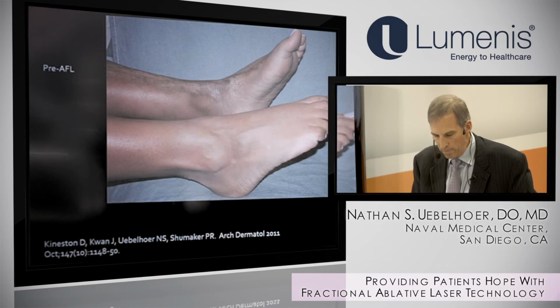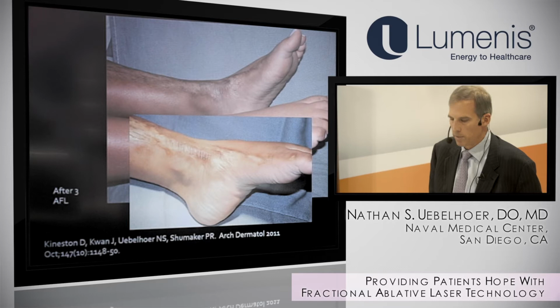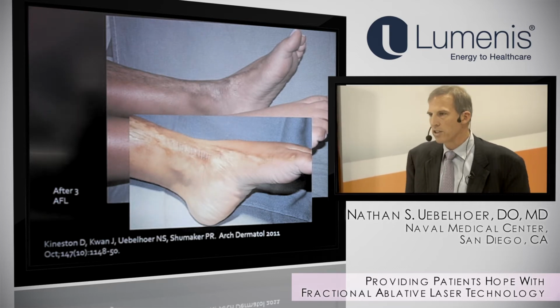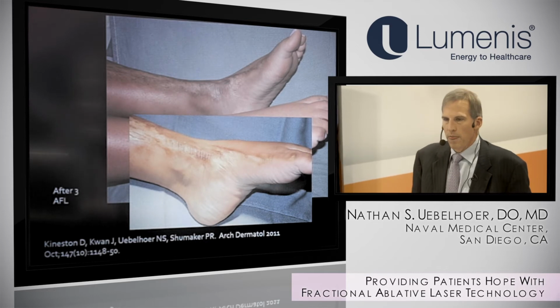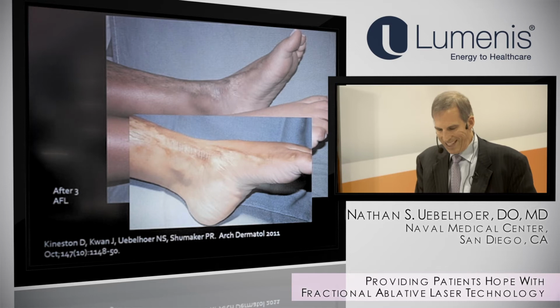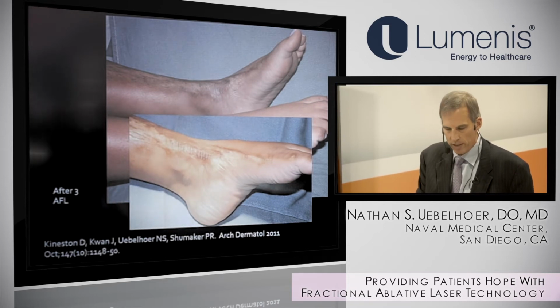And that was enough for her to come back. We treated her a couple more times, and we published this in the archives, now JAMA Dermatology, where she was able to get essentially full range of motion. She could still feel some of the tightness, but the pain was gone when she was walking. She could now ambulate normally, and she could dorsiflex her foot the same as she could with the other side, on the right side.